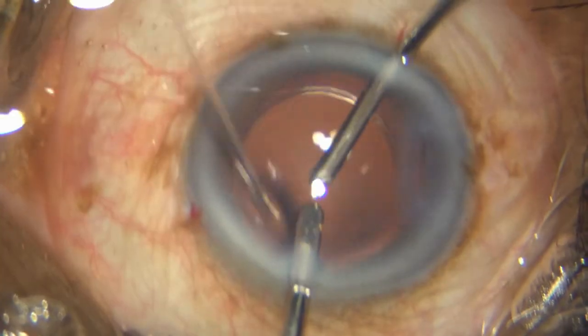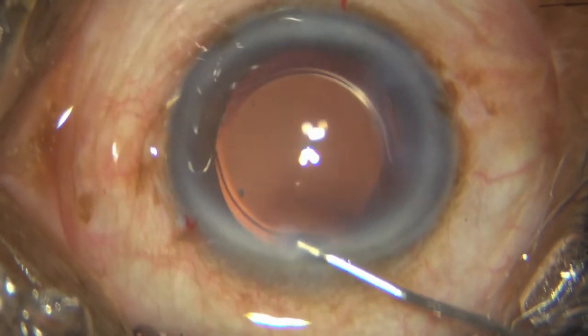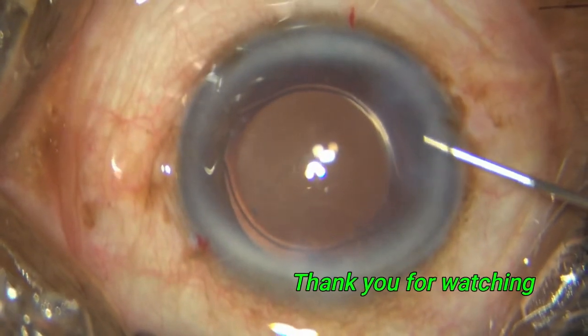So I just go ahead and inject my single-piece hydrophobic lens directly into the bag, take out the HPMC, put in my intracameral antibiotic, and conclude my surgery. Thank you so much for watching.